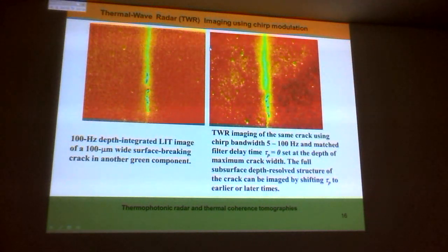What about background noise from the IR cameras, for example? Because you're dynamic, the noise level of the camera, because it's cross-correlated, just goes down to the baseline. You don't have much background noise itself. I mean, yes, there is thermal noise in the camera. That is always there. But don't forget that these cameras are cooled internally too.